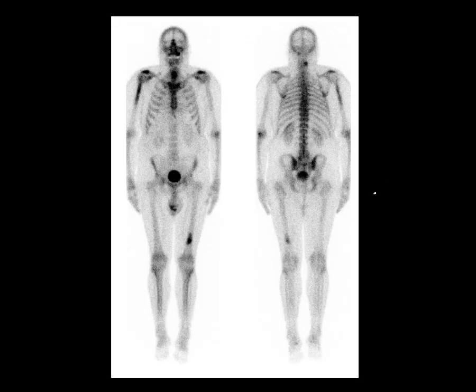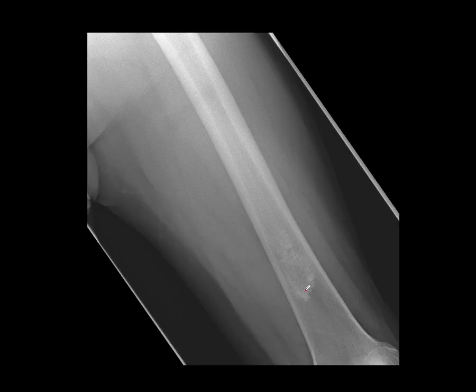Let's have a look at another one which is rather similar. This one is perhaps a bit more concerning because there are two of them. You can see some facet degenerative change and some lumbosacral degenerative change. There's a rather linear, quite large area of increased activity in the right proximal humerus and in the left distal femur. We did take radiographs of these areas — I'm not sure if this is a bone infarction or some sort of cartilaginous matrix, but it's certainly consistent with an enchondroma.